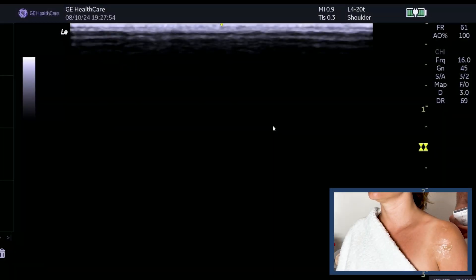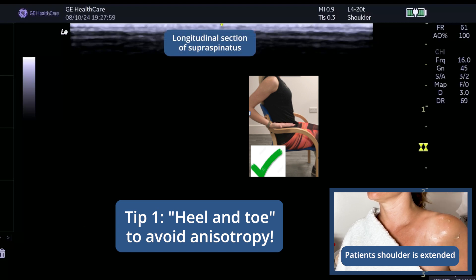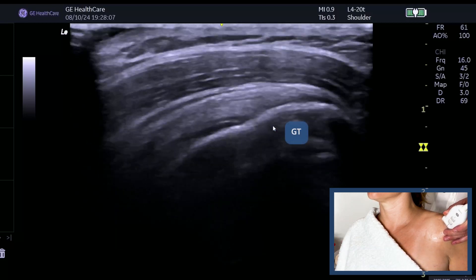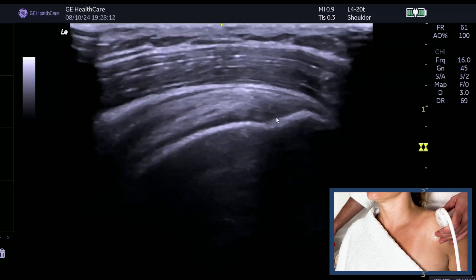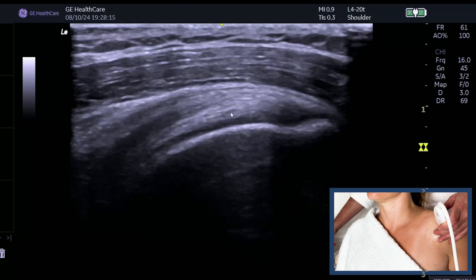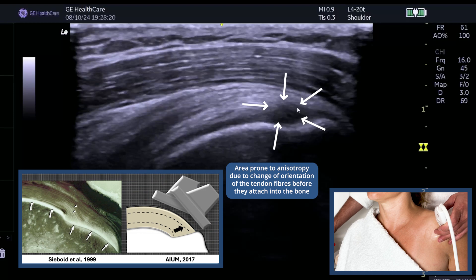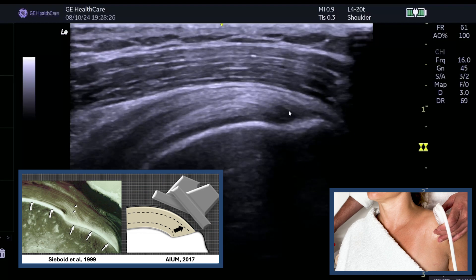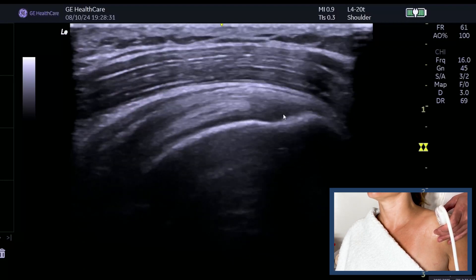I want to show you a little tip for when you're scanning supraspinatus. If we put the patient into a shoulder extended position avoiding abduction, I'm going to show you how important it is, particularly in the long section, to use your heel and toe. If we look here, we've got the greater tuberosity. You can see supraspinatus here. We all know we get this dark hypoechoic region — this is the anterior aspect of supraspinatus and this is the articular surface, a very common area for a tear. So you must heel down the probe.